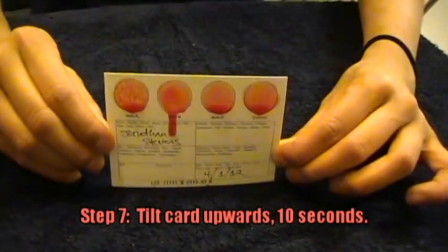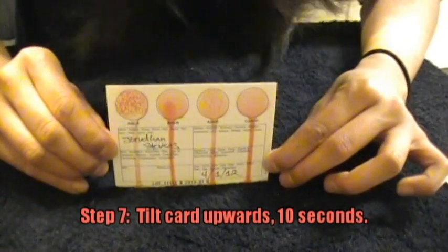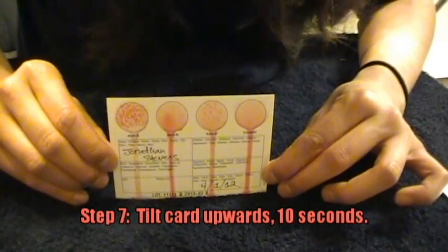We're going to tilt it upwards. Ten, nine, eight, seven, six, five.